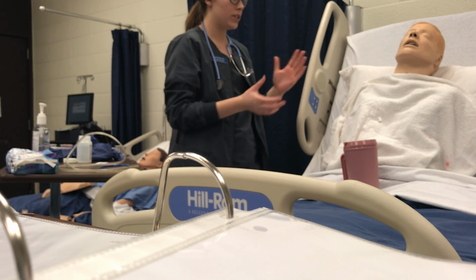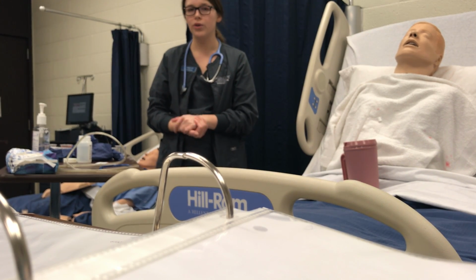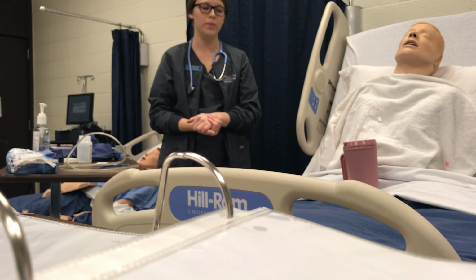So I would verify the patient. I would ask for their name and date of birth. I would check that. I'd also verify the order, that I do have an order to place the NG tube.